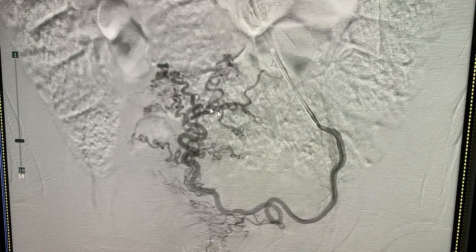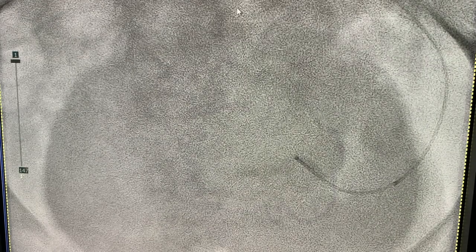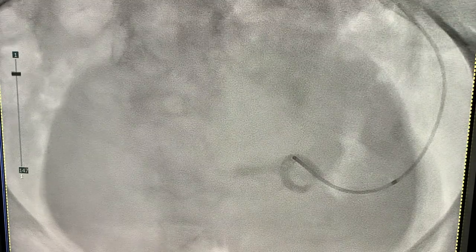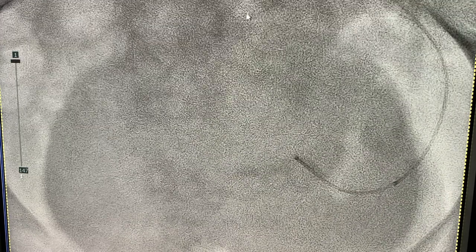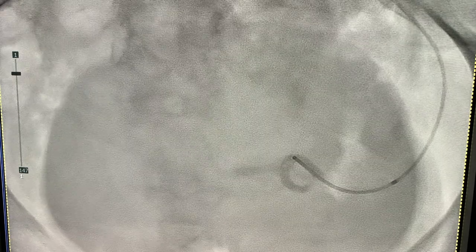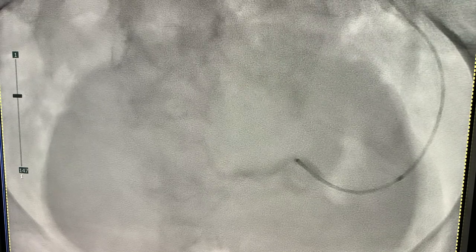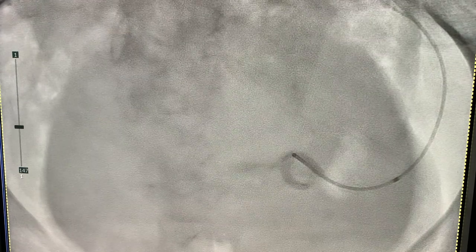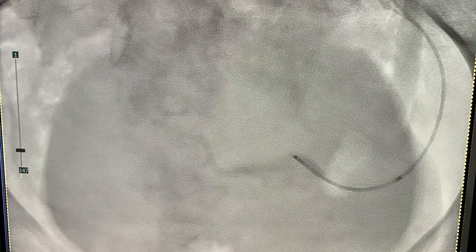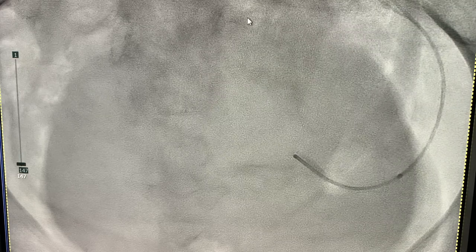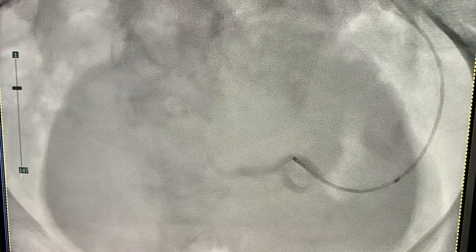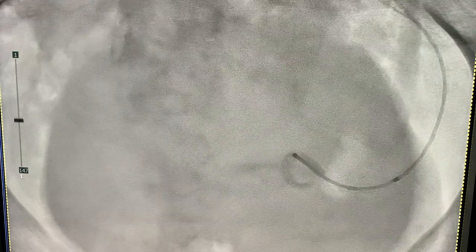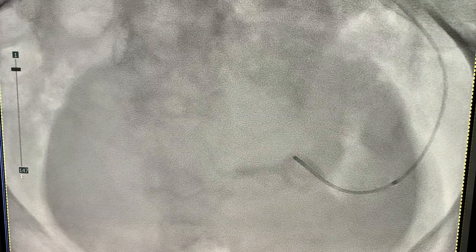Here we're in the left uterine artery with several hypertrophied branches. We're now in the horizontal portion of the uterine artery, going a little more distal than the prior run to allow more room for reflux. We're embolizing with particles — specifically 500 to 700 micron particles. We usually start with those before moving on to bigger particles.